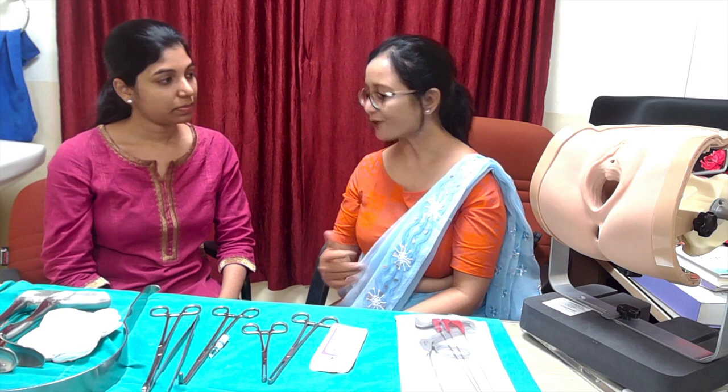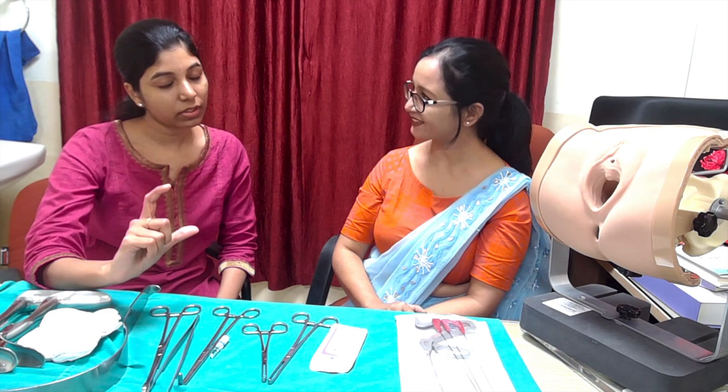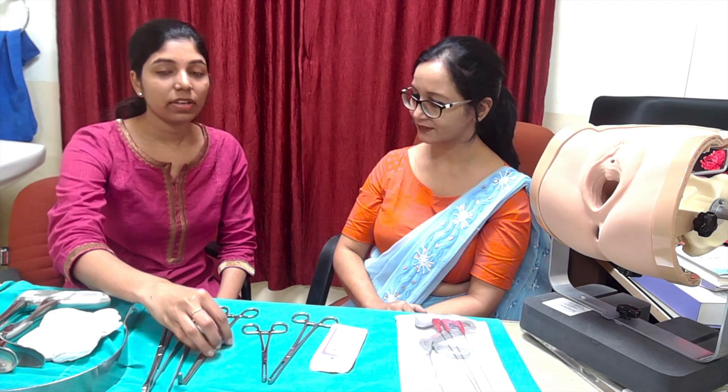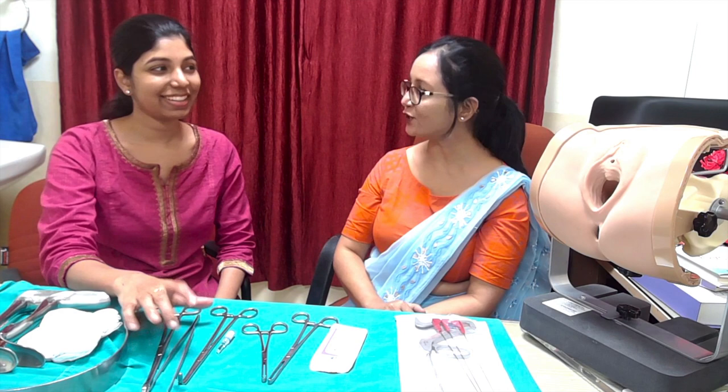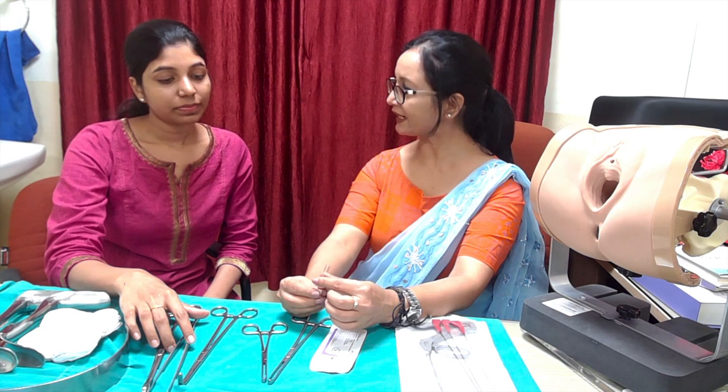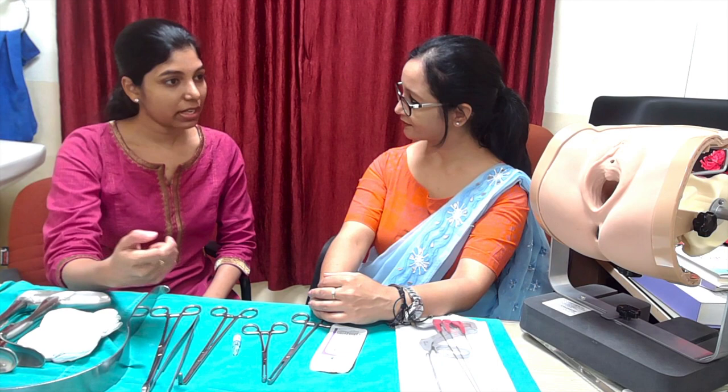This incision placement is very important — if you're off, you'll either enter the rectum or open the pouch of Douglas. One advantage of sacrospinous fixation over abdominal procedures is that it is totally extraperitoneal, so the risk of complications is much less. For the incision, we first do hydrodissection with diluted adrenaline — 1 ml of adrenaline in 200 ml normal saline — and we take 10 cc of that to get the planes and decrease bleeding.